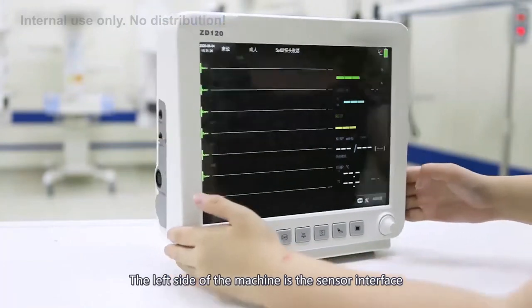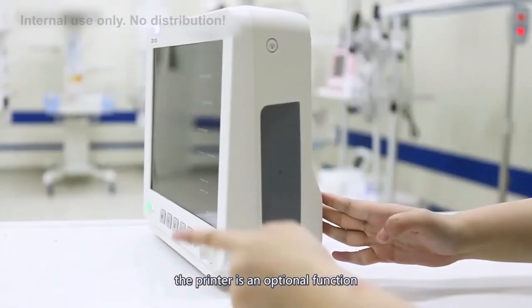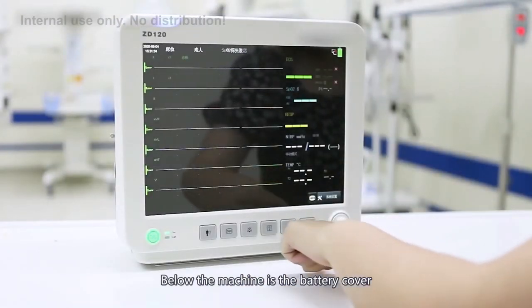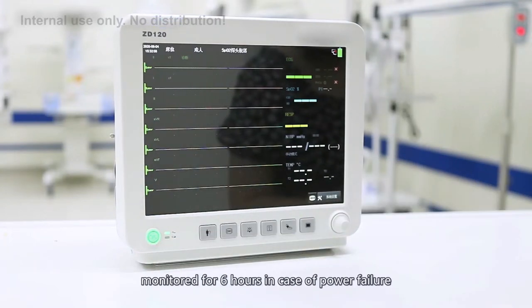The left side of the machine is the sensor interface. The right side is the printer slot — the printer is an optional function, and the standard configuration does not include printing. Below the machine is the battery cover, which contains a high-endurance lithium battery that can support continuous monitoring for 6 hours in case of power failure.